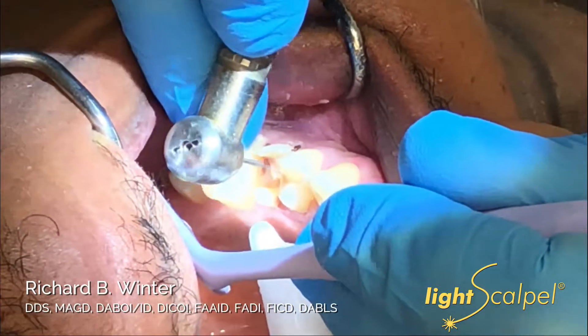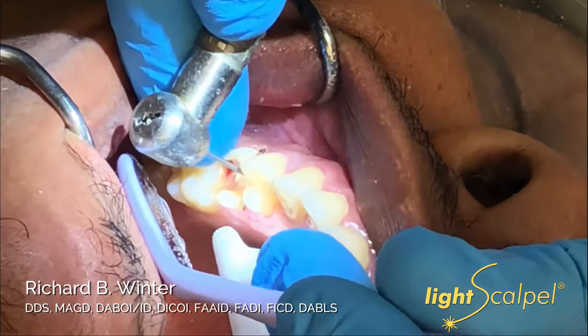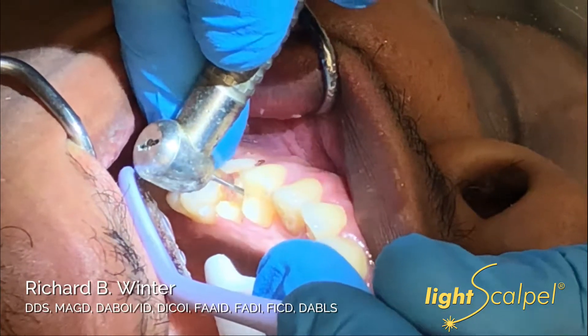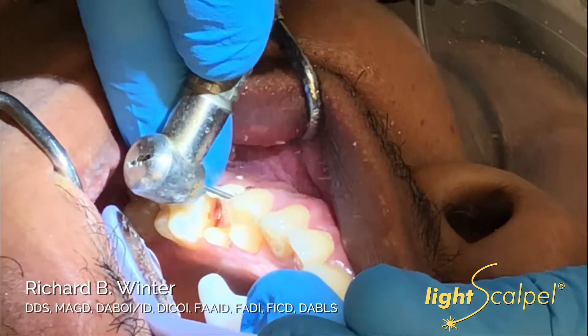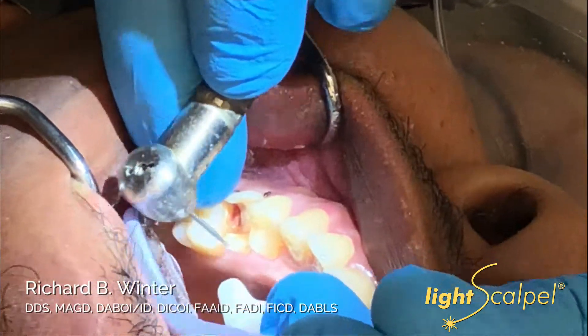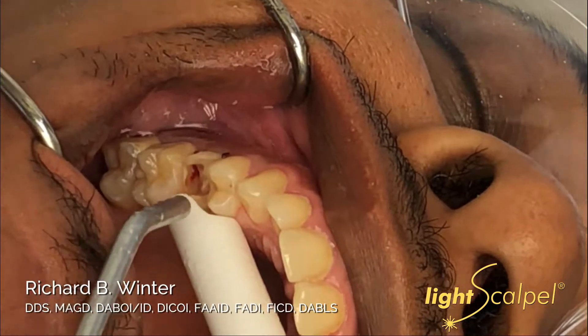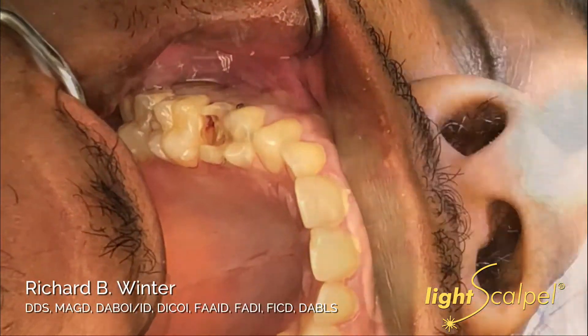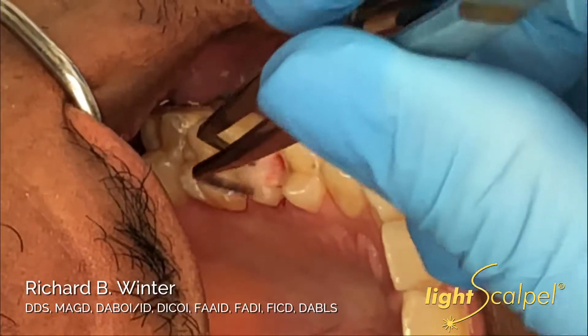You can feel with this really fine bur where the bone is. We'll go back and confirm it with a periodontal probe in a little bit as well. Then we'll take a cotton pellet just to make sure, and do the proximal — so the left and the right.